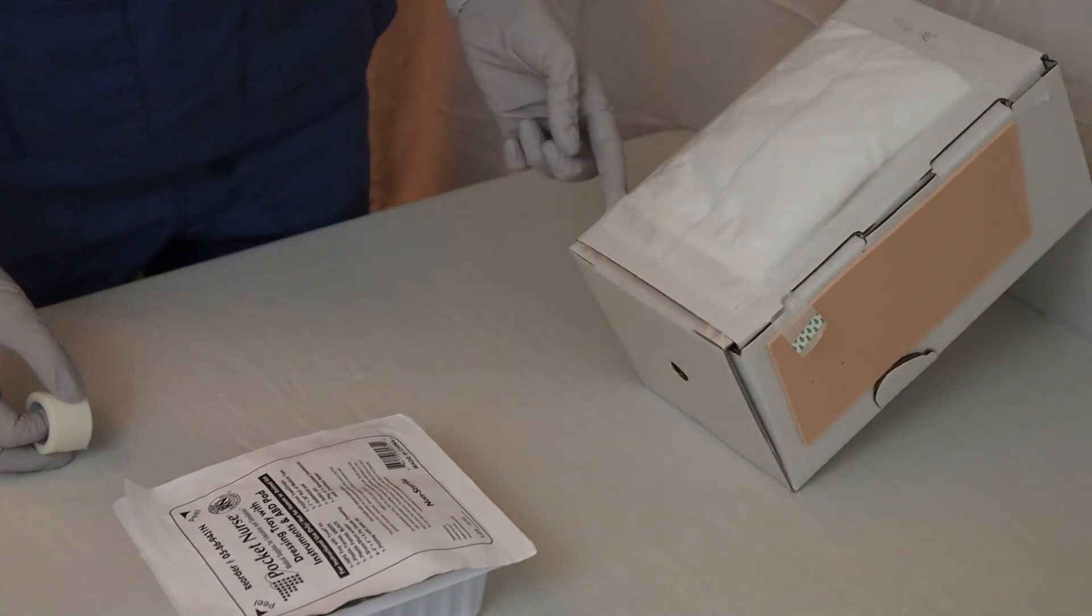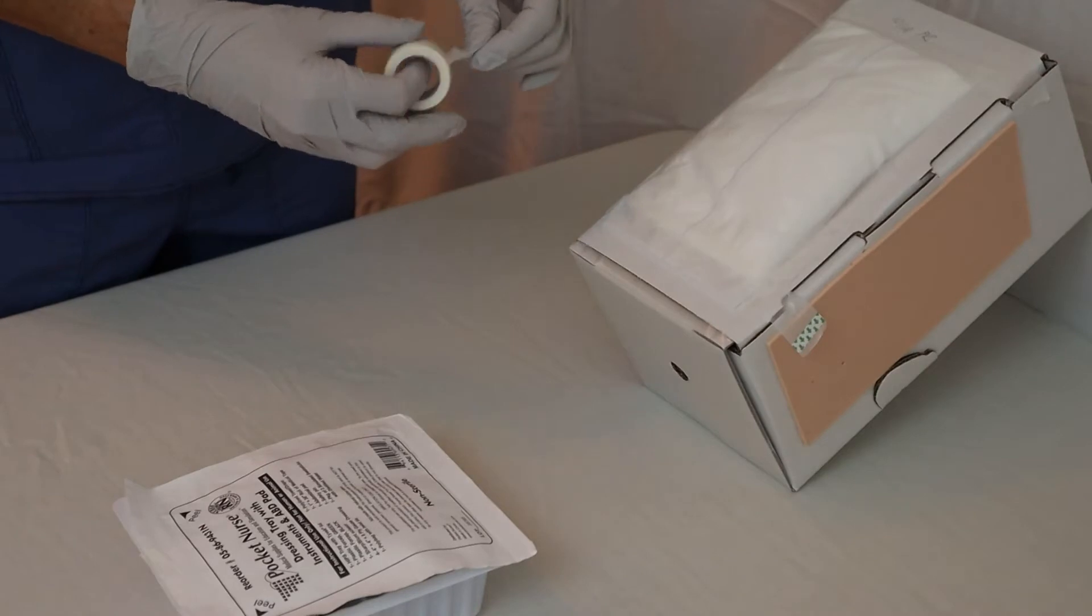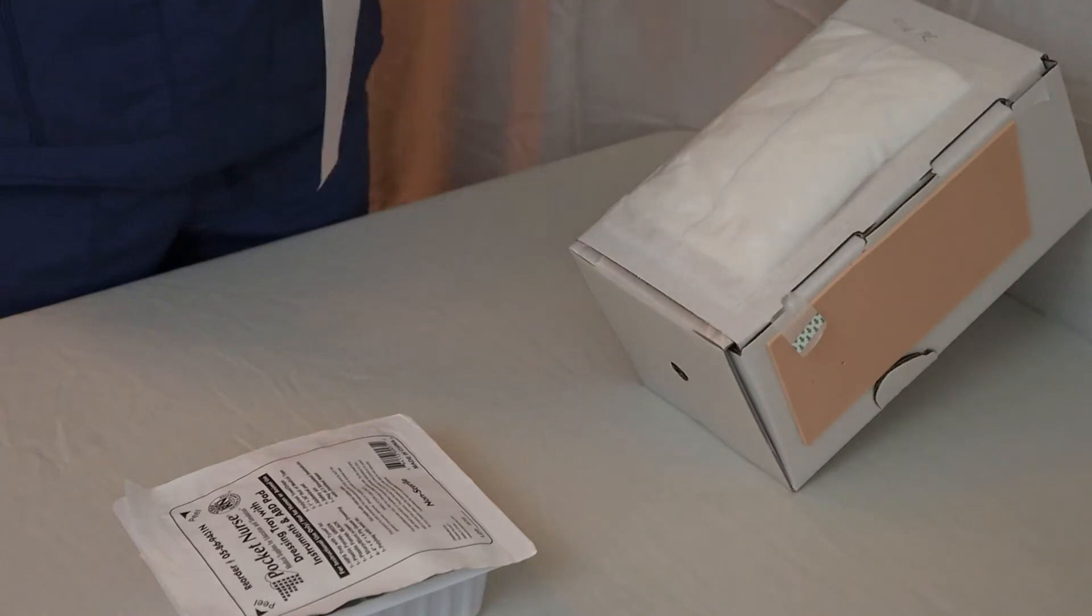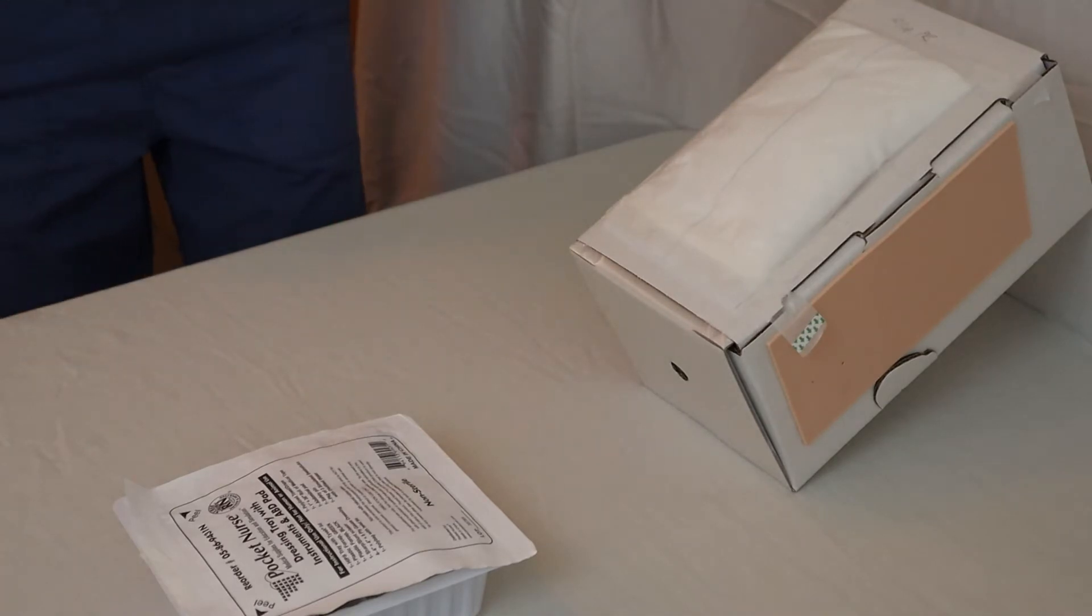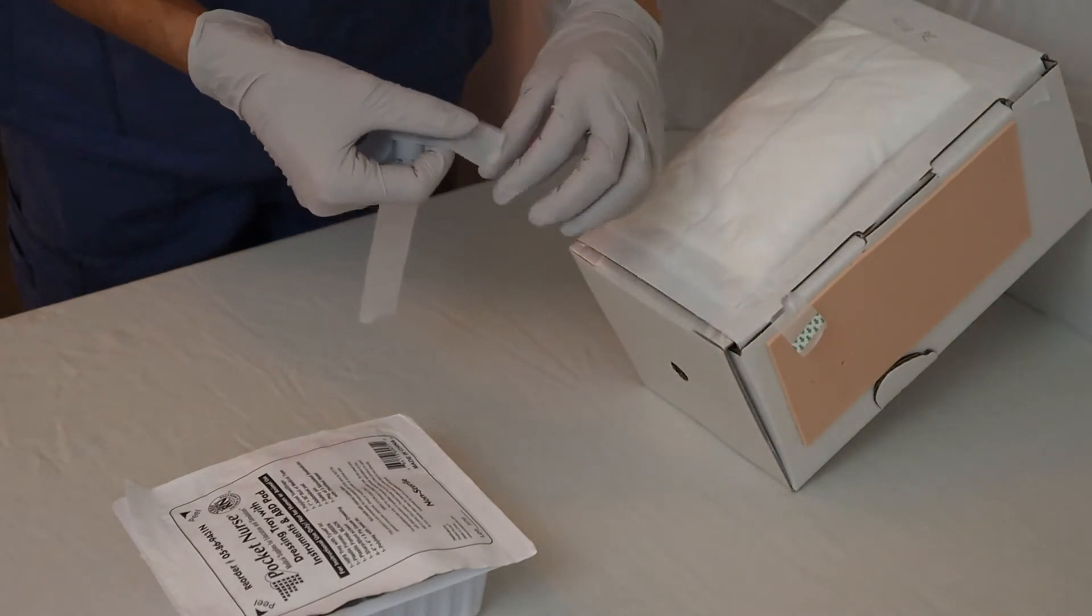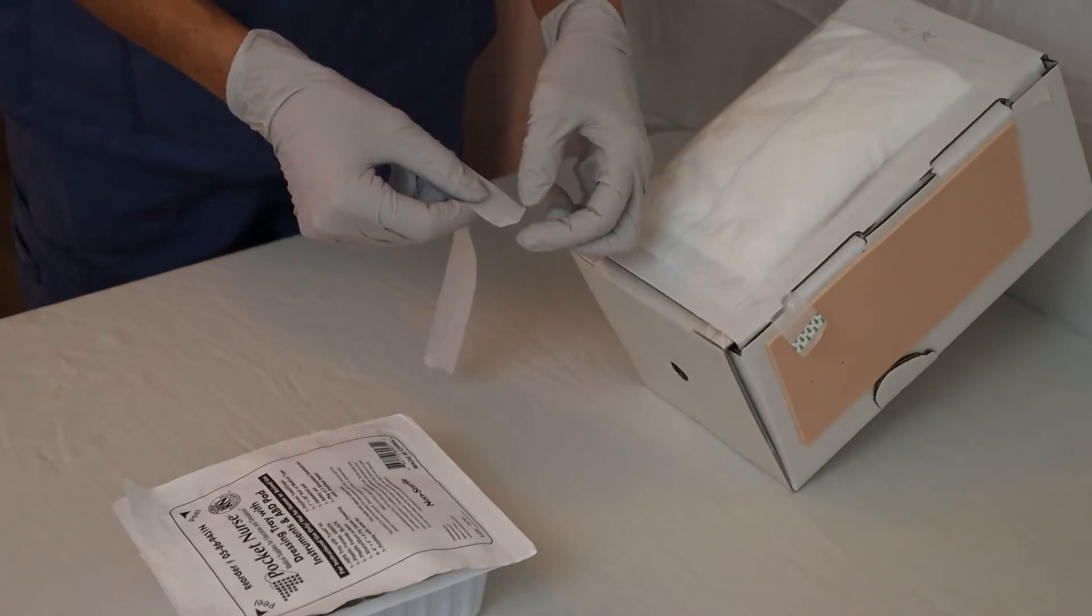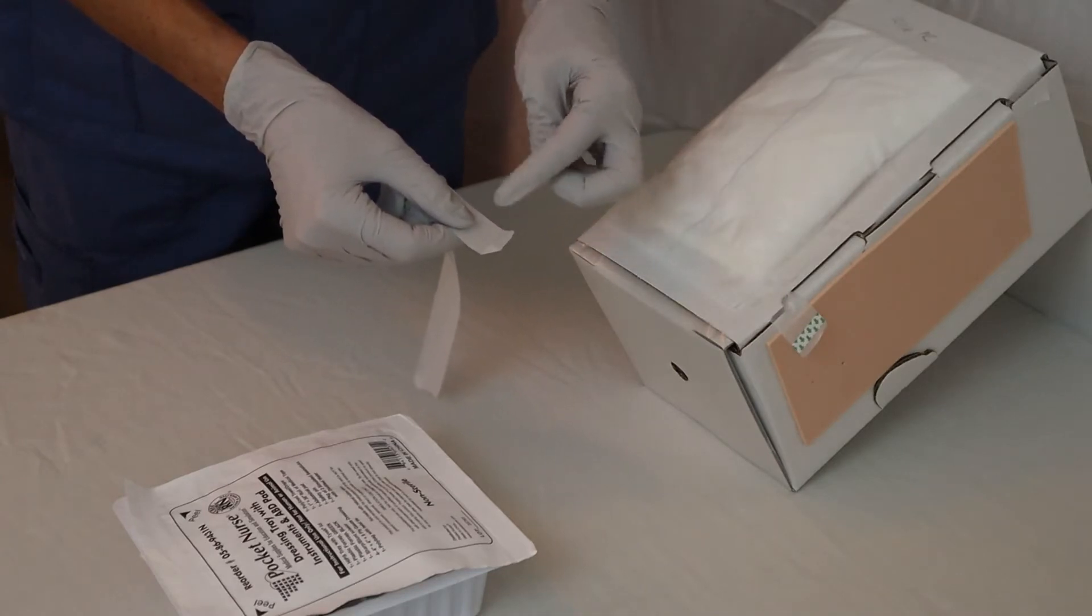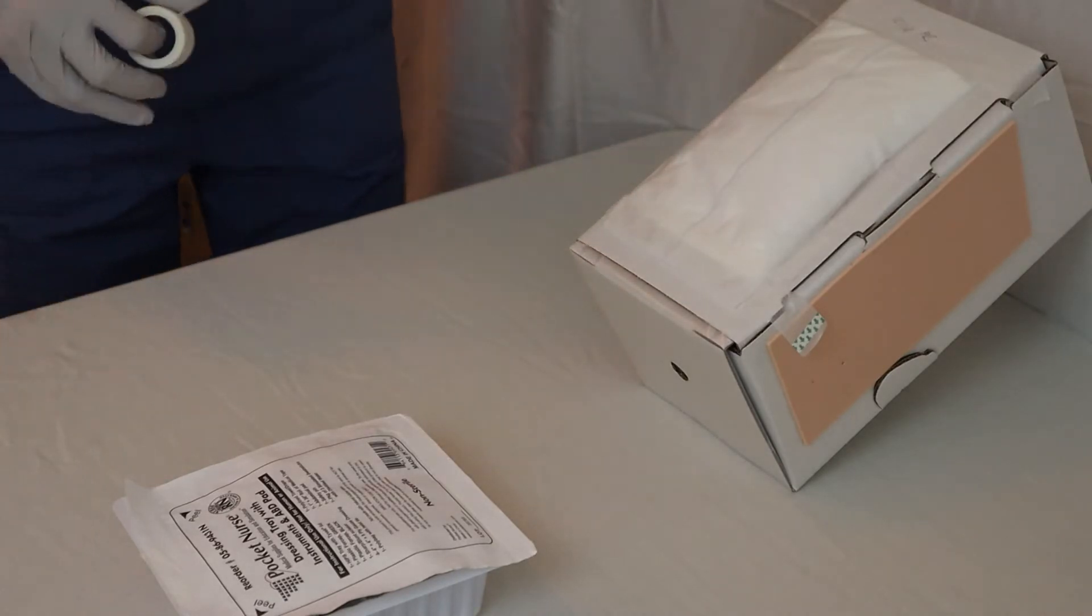So in order to prepare myself better, I will again also use paper tape and I can measure the length of the tape strips that I'll need by just measuring the length and tearing them off and then placing them at the bedside table where I can easily get to them later on. Another trick is to make a little tab at the end of the tape, which later will help you once you remove the tape off the patient's skin. It's much easier to come off when there's a tab. Otherwise, you might have to really dig underneath that tape to get it off and that might not be good for the patient's skin nor might it be very comfortable.